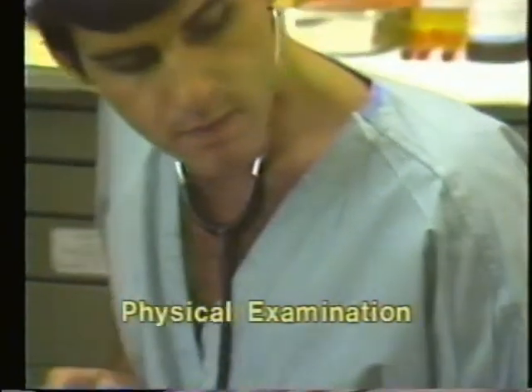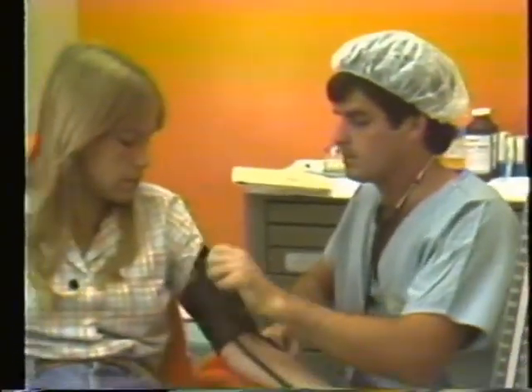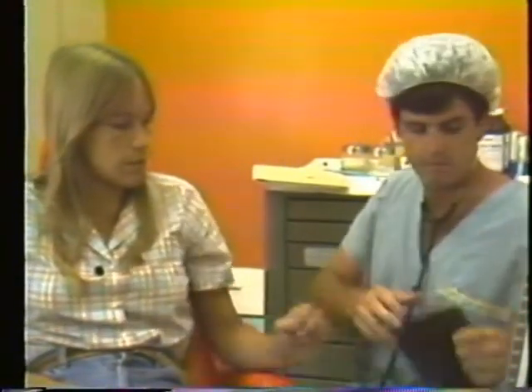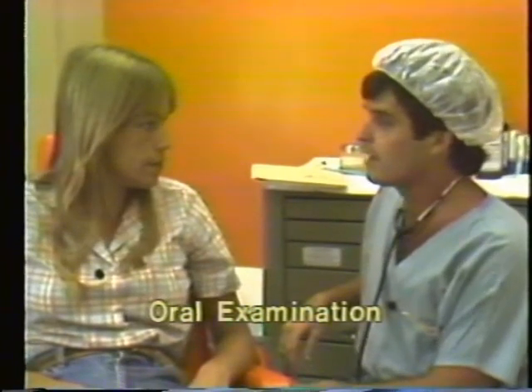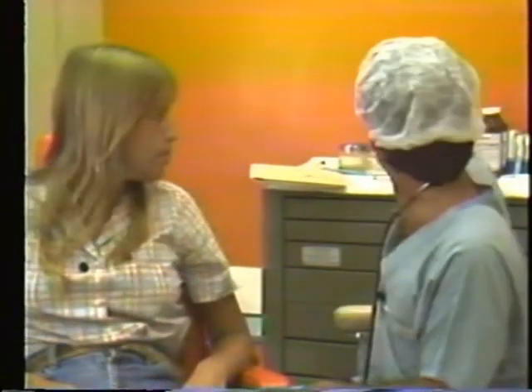A brief physical examination of your patient is then performed. This includes taking a blood pressure and pulse. Then, a complete oral examination is given. Okay, now I would like to take a look in your mouth. Okay.